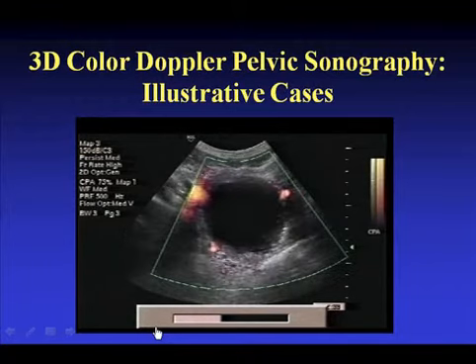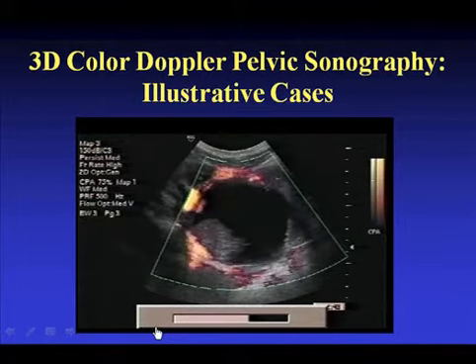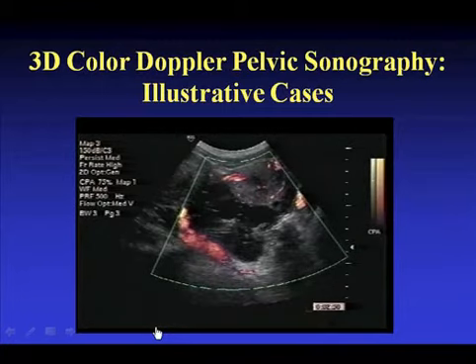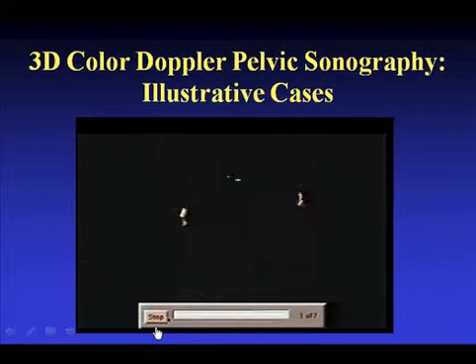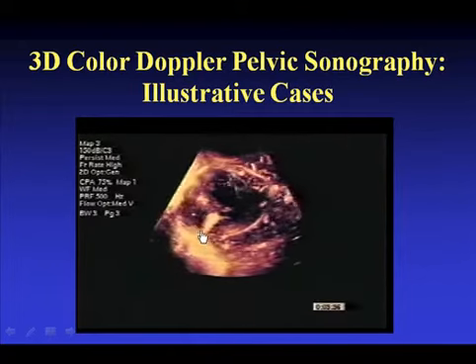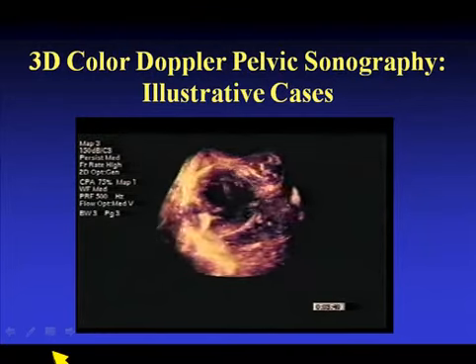We're finding an echogenic papillary area, and we can see that there's a small vessel going to it. When we post-process this image, we can see that there's a large vessel going to the area of abnormality right here, which supplies the ovarian cancer.